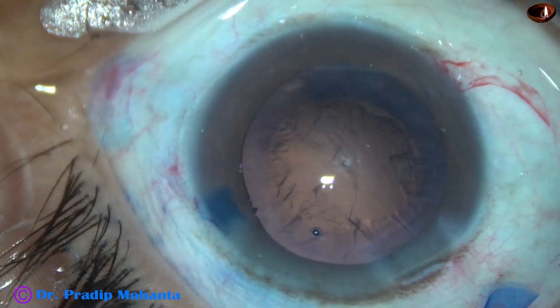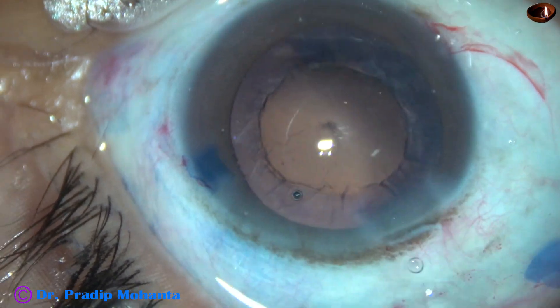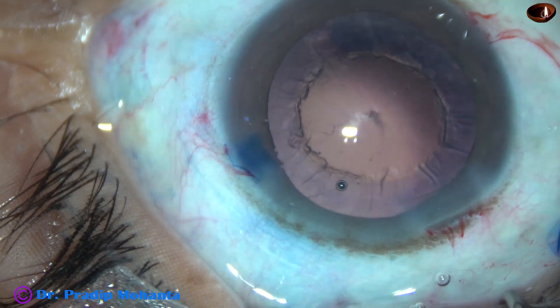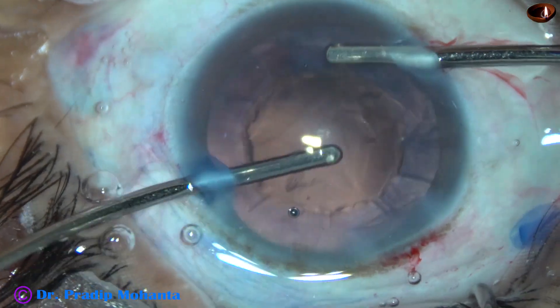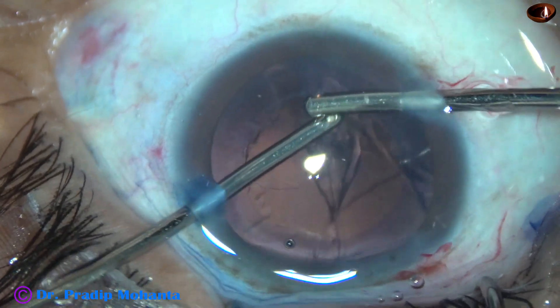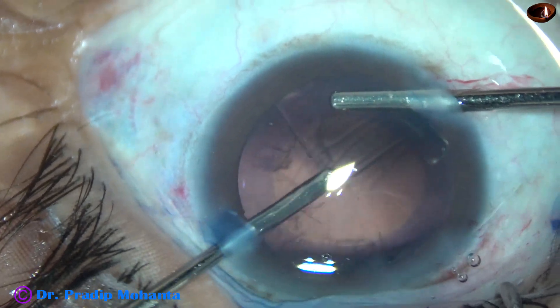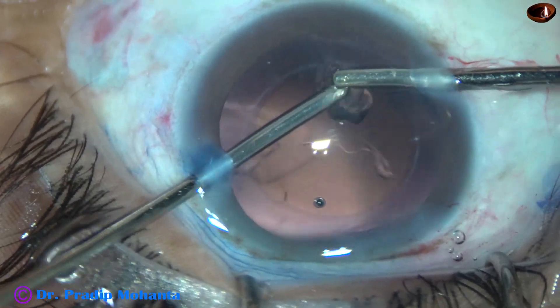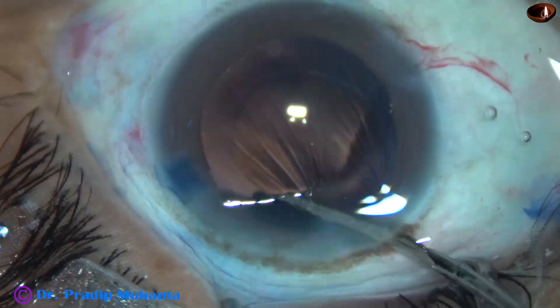And now cortical cleanup. In this case, I am going to use bimanual irrigation aspiration for cortical cleanup. A little bit of viscoelastic is added. Irrigation is from the right side port, aspiration from the left side port. I am going to try to remove the whole cortex in one go — starting from 11 o'clock, and now removing the cortex at 2 o'clock. And ultimately, the whole cortex has been removed in one go.